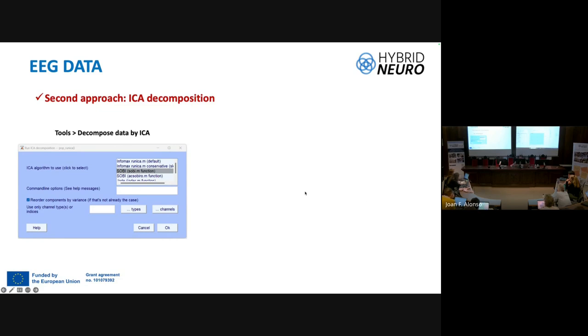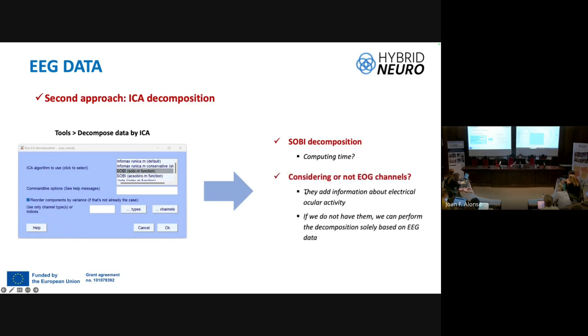Another important consideration is whether we should include or not the EOG channels for the decomposition. In previous studies in the literature, it has been reported that EOG data aid in the decomposition as they add valuable information about the morphology of ocular activity. Okay.